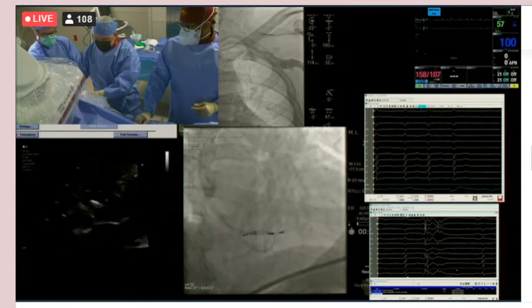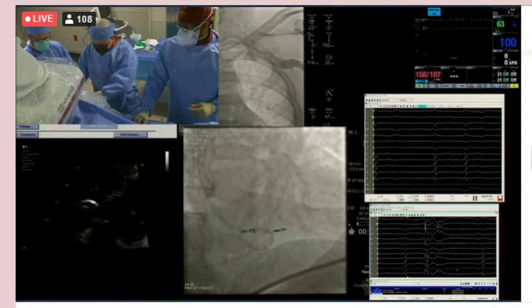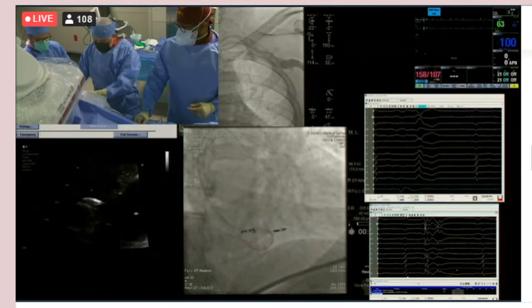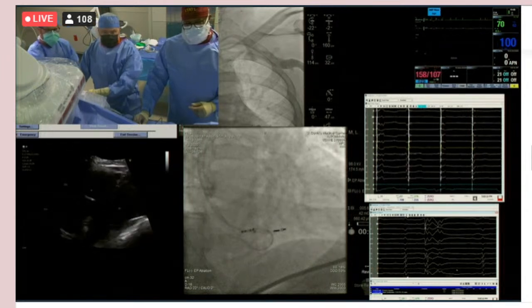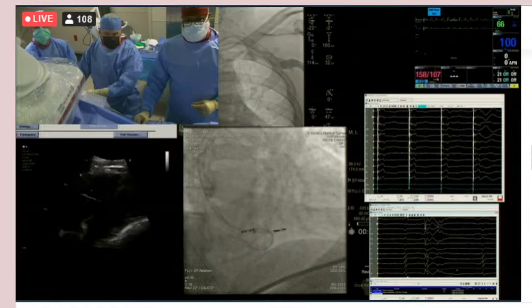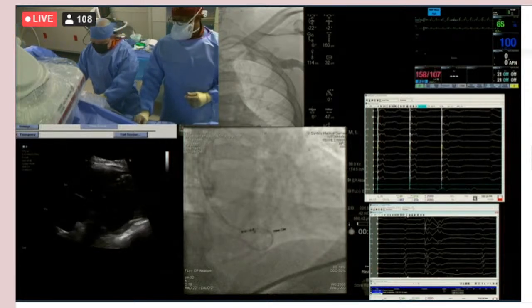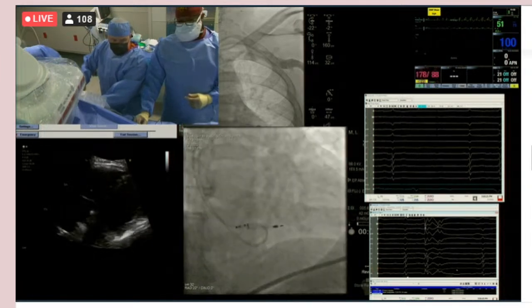That's the other issue. Hold that. Just hold the counterclockwise. Once that happens, usually it doesn't take a whole lot of turns for it to do it, and it should go in pretty easily. So again, we've got roughly the general ballpark of where we want to be. It's sort of an equidistant or QS. So now I'm going to start rotating it.